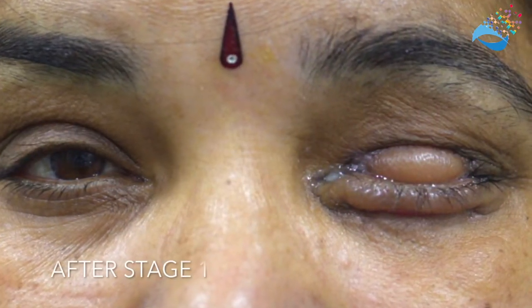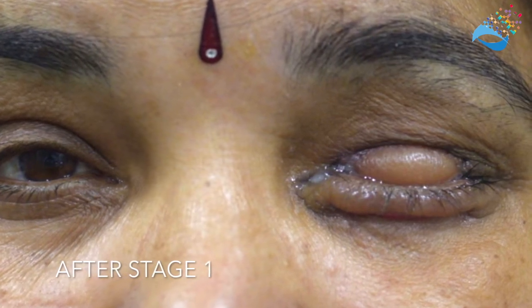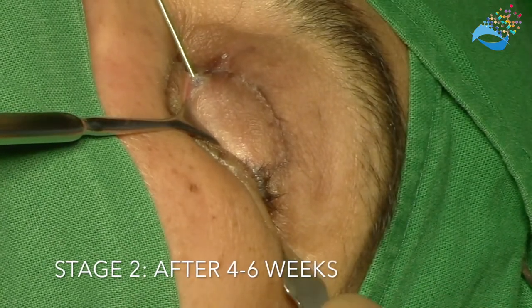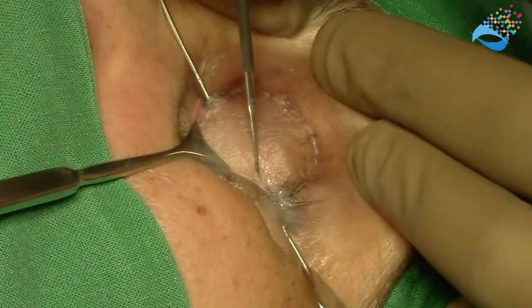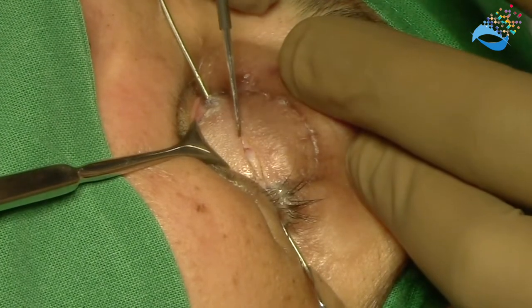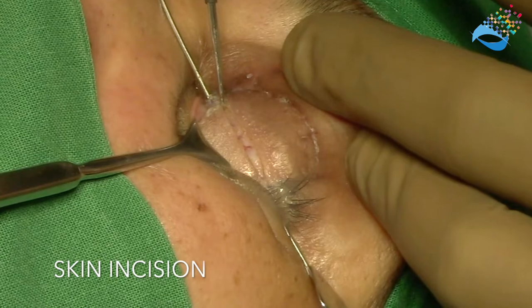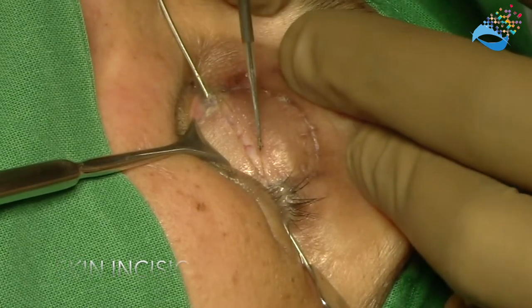Here is the patient immediately after stage one. Four to six weeks are given for epithelization and wound healing, following which the flap is then separated. The incision is made with electrocautery in a downwardly convex shape.